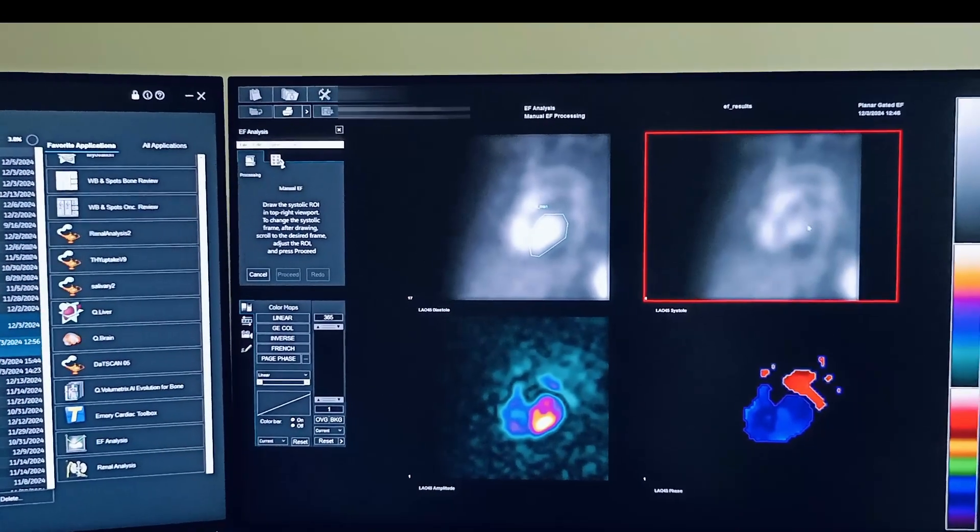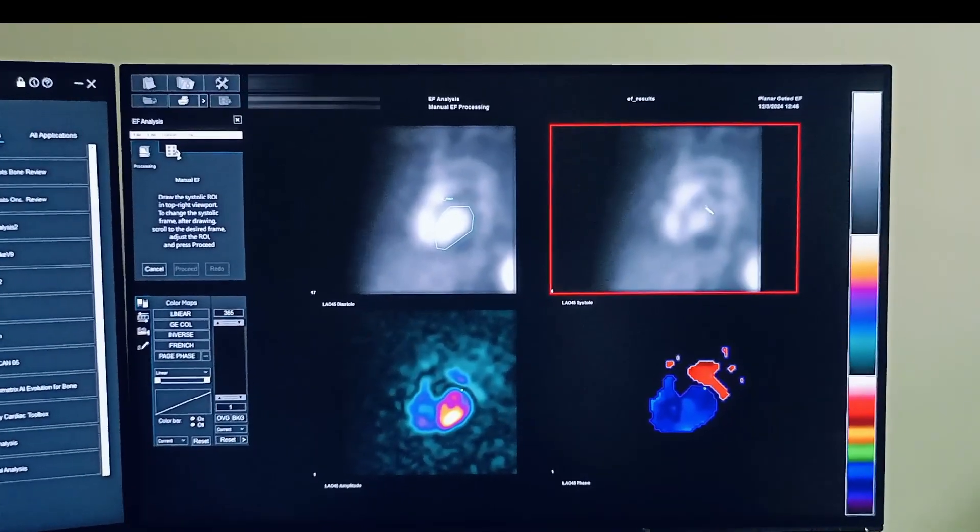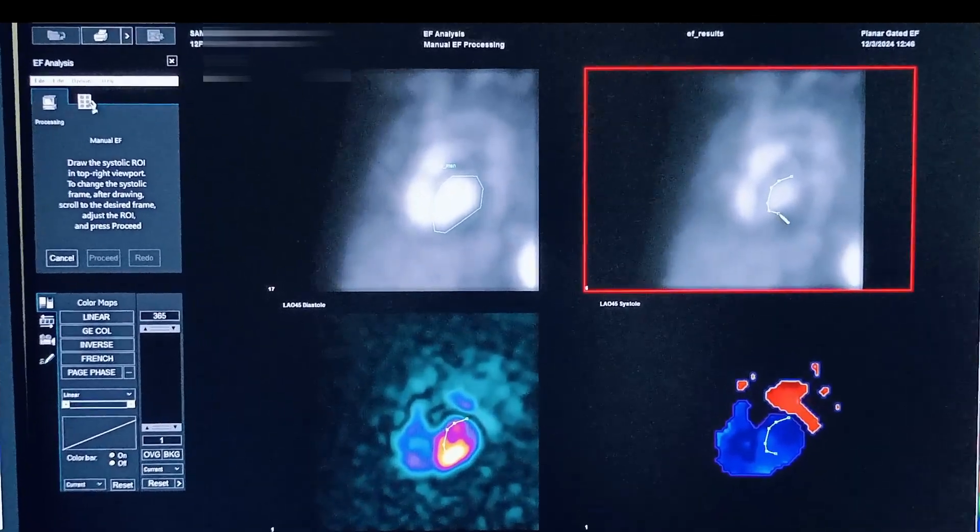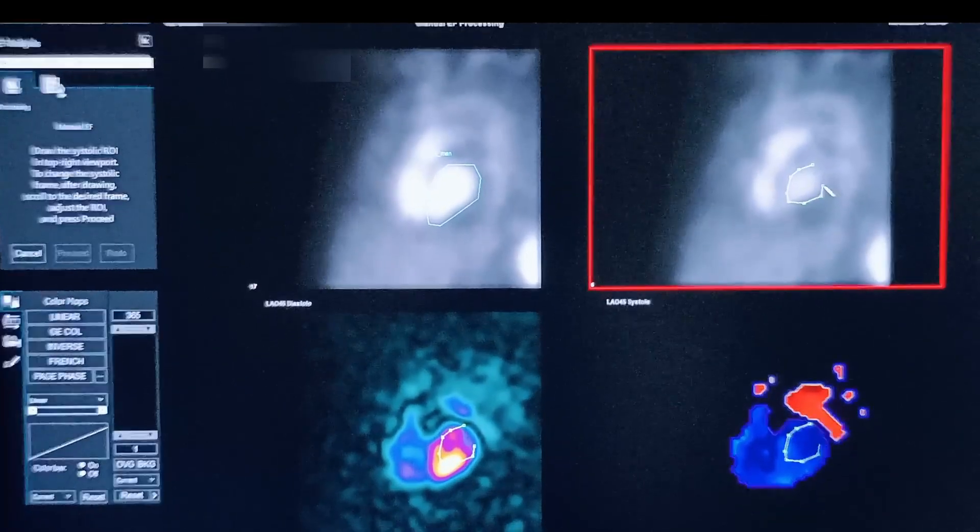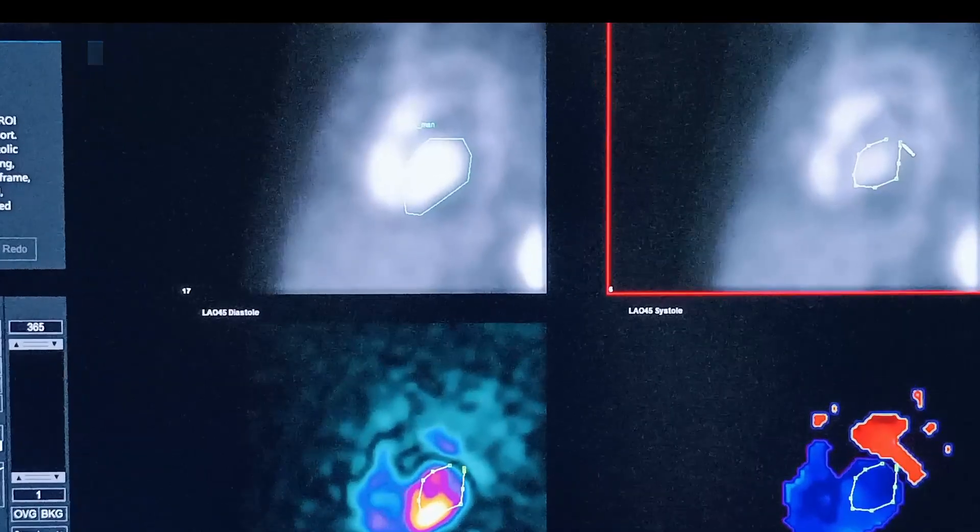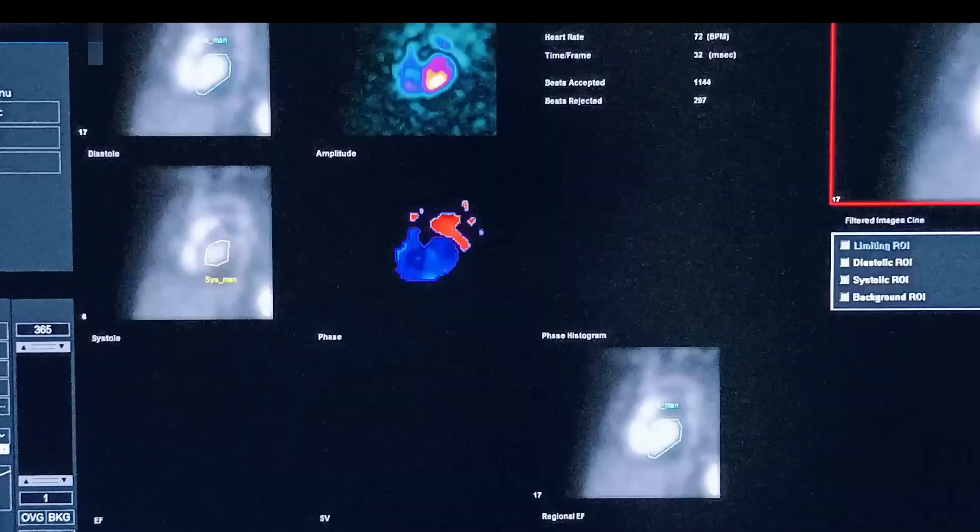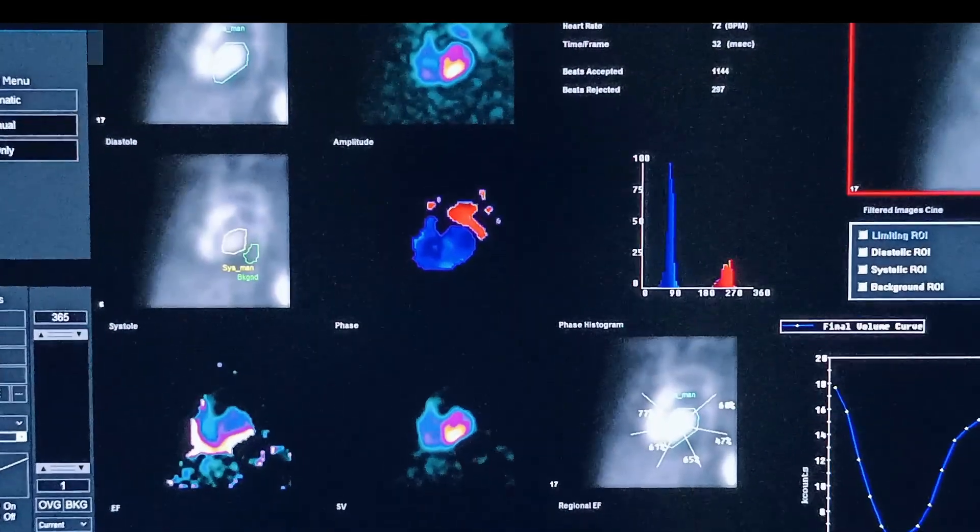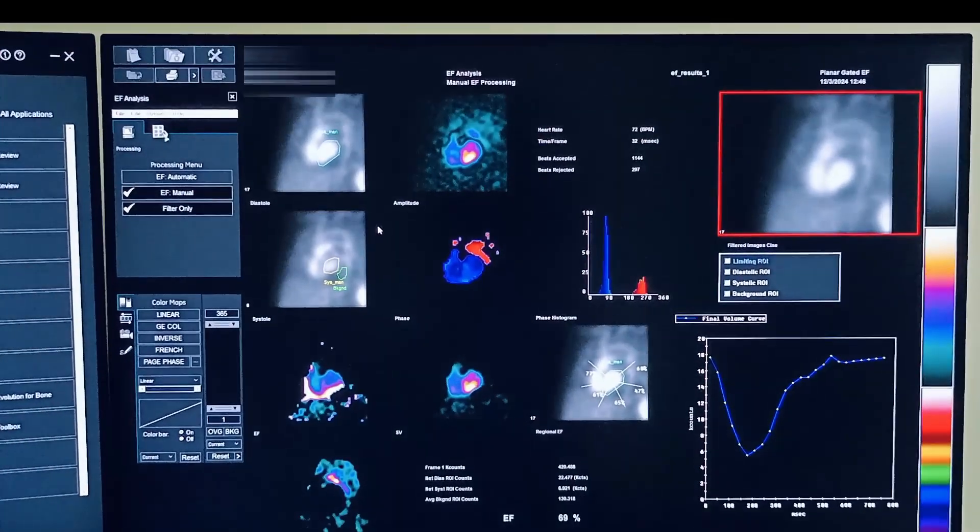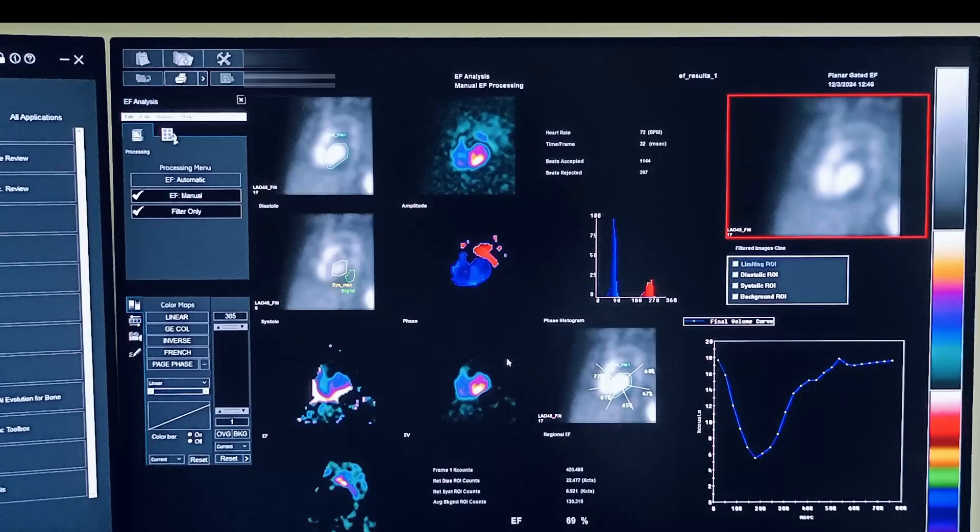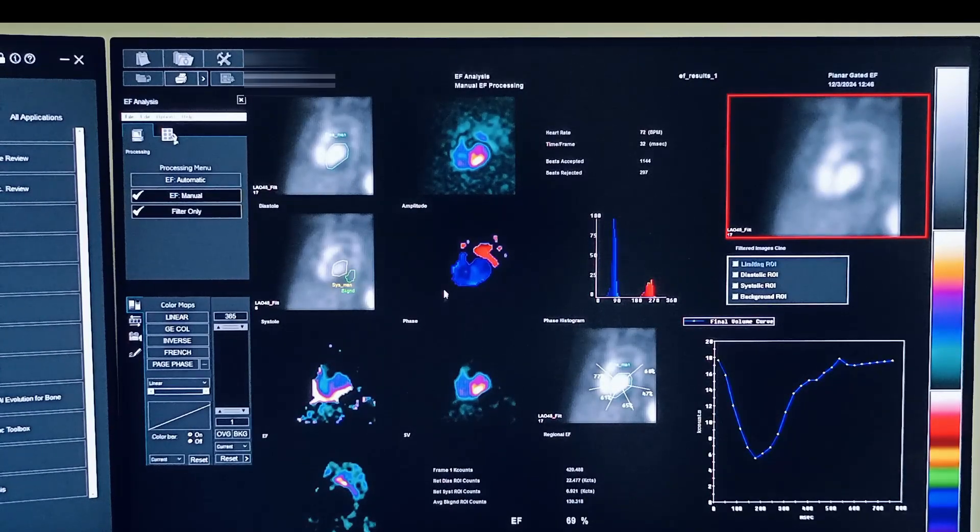Now draw on the systolic. And this is the result page.